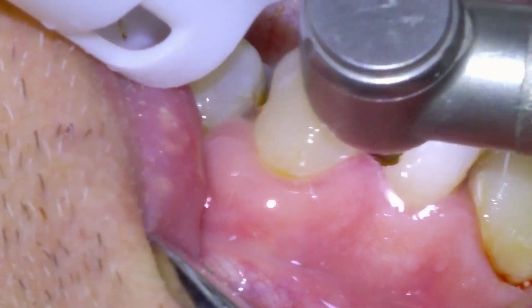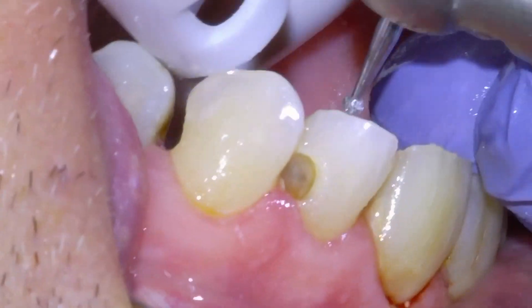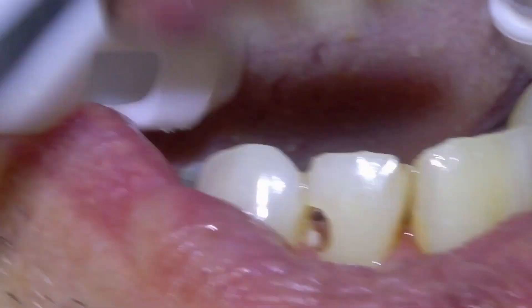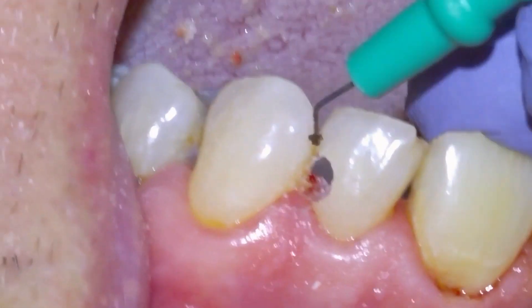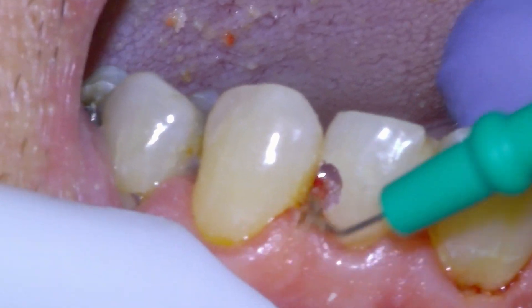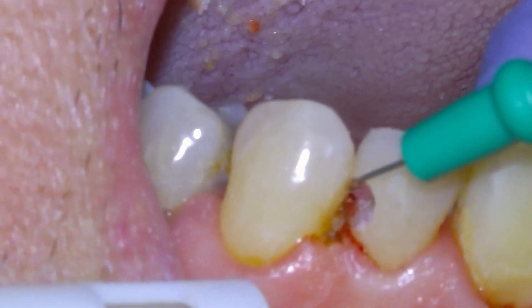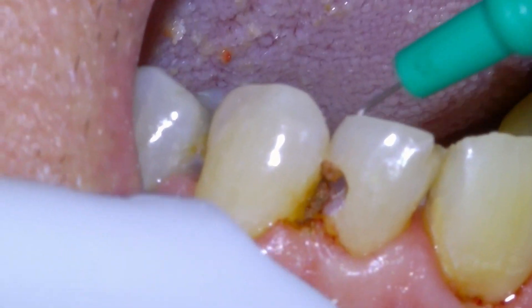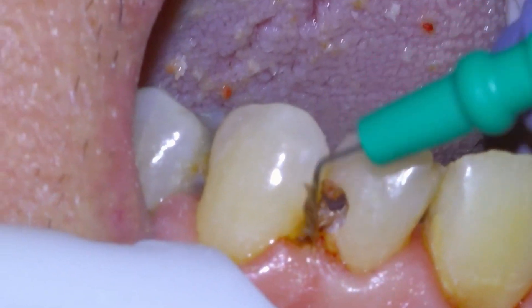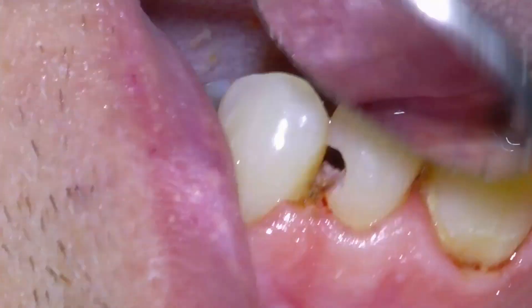Now that all the tooth decay is removed, we're going to refine the margins of the tooth with this high speed diamond burr. Occasionally when a cavity goes below the gums, like it did in this case, we'll actually remove the gum tissue so that we can see the margin of the cavity. We're using this electrocautery unit to ablate the gum tissue until we have reached the clean margin of the tooth.